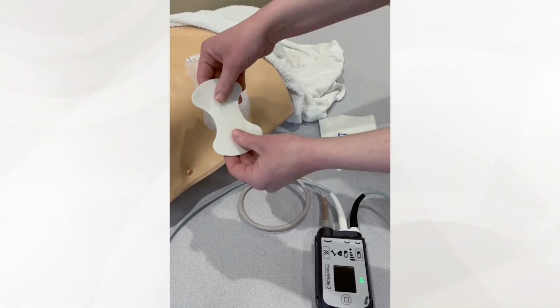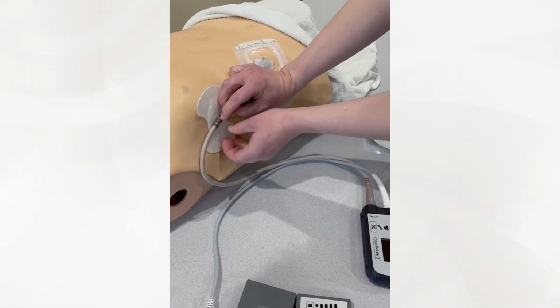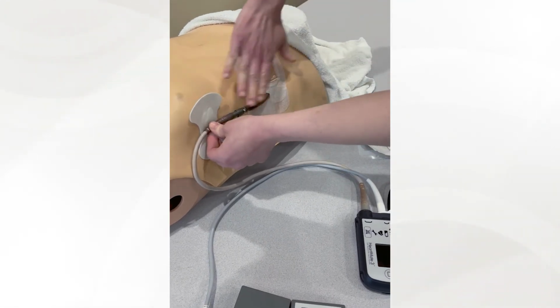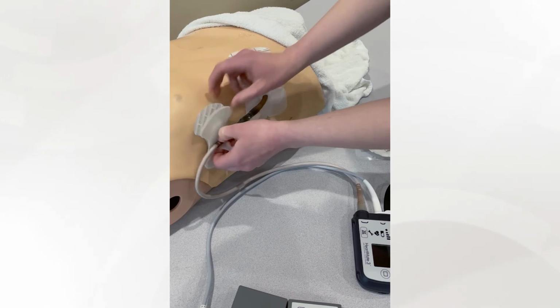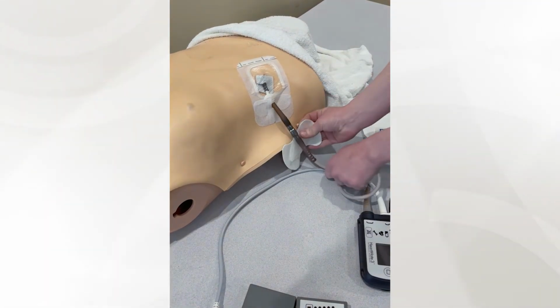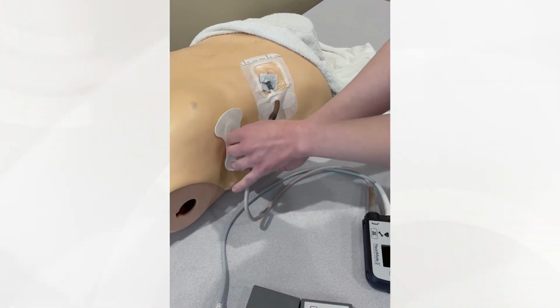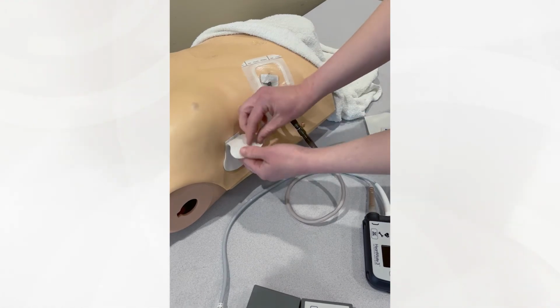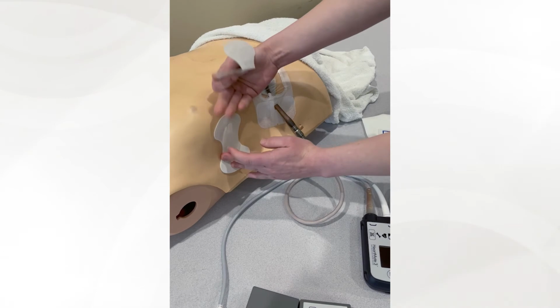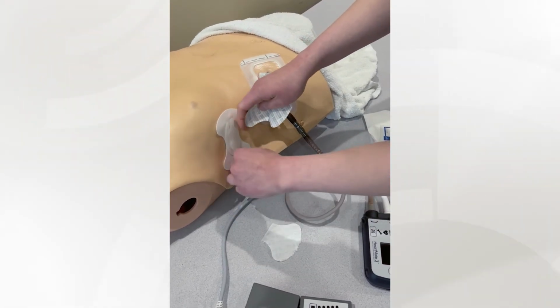So on this anchor, you're gonna want to place it somewhere where the patient is comfortable or your family member is comfortable. So it's either gonna be up here, likely it'll be a little lower, less close to the armpit, or you can do it down here, just wherever's comfortable. On the back is also a good spot. For demonstration purposes, I'm gonna put it up here where you can see it. So this also has tabbies, so you could anchor your anchor from one end, let it fall into place, anchor it from the other end, let it fall into place.